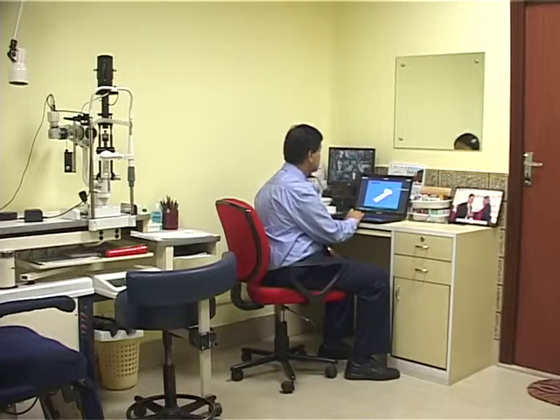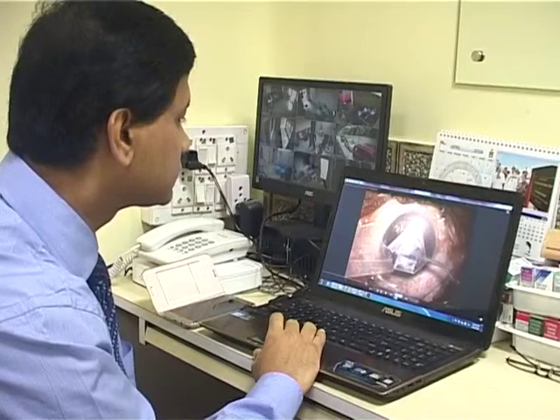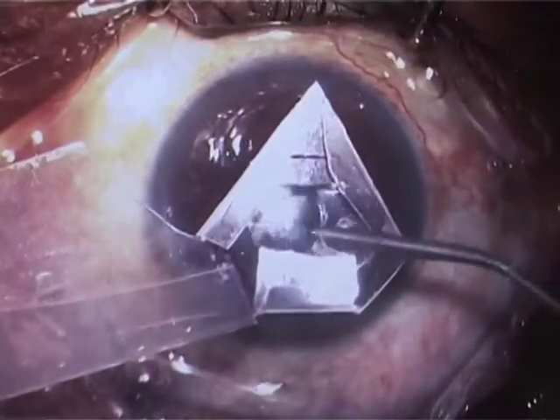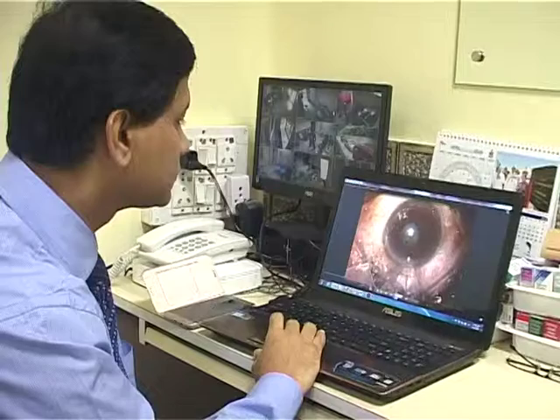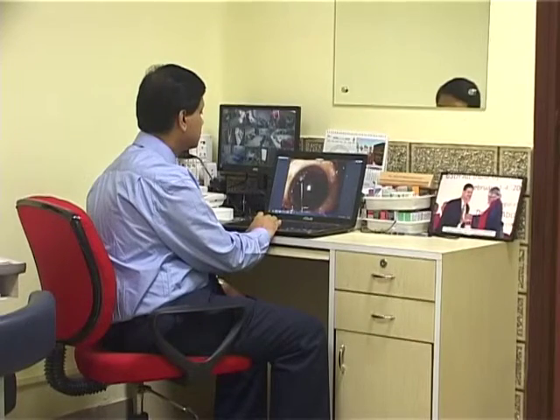This device is easily inserted and removed through a 0.9 mm incision. It has a vertical profile which is one-tenth of other expanders, and for that reason it is much safer in eyes with shallow anterior chambers.